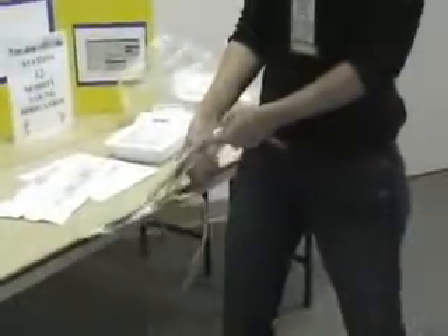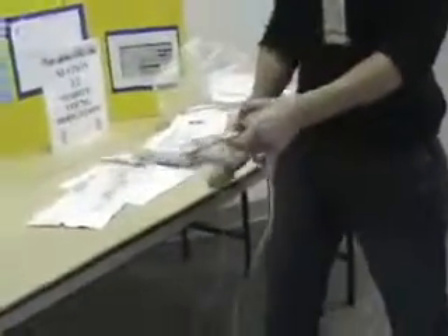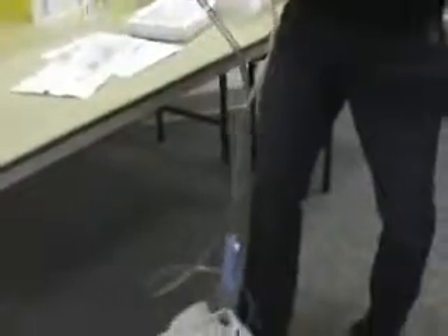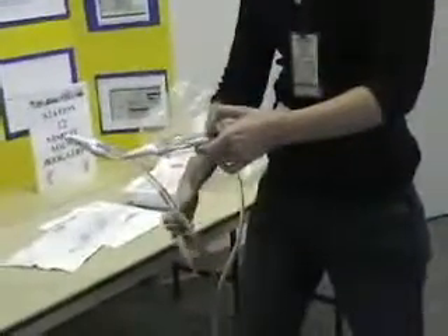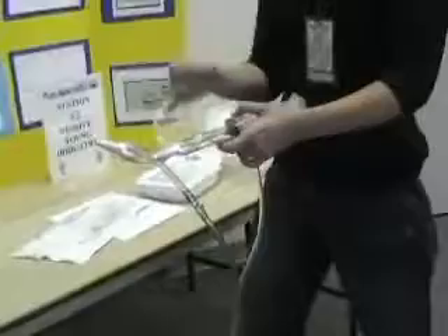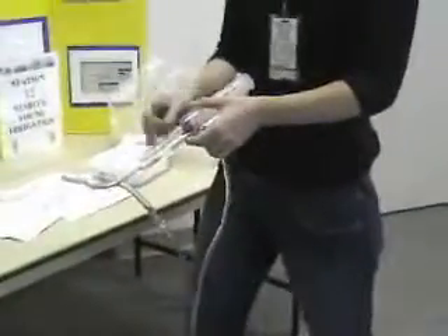Once you're done, you're going to release the clamp and let everything flow into the gravity drainage bag. All of this is what's coming out of the bladder into the actual bag. You want to see what color it is and how many clots there are, and you record that in your charting so the doctor knows if it's really cloudy. You go by small, medium, or large clots. If you feel like you need to irrigate again, you can do it again at that time.